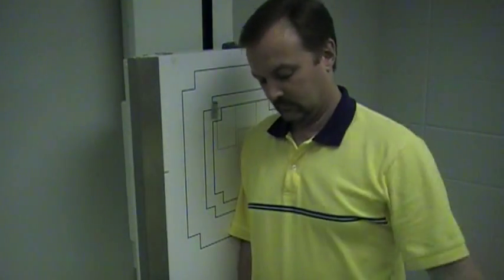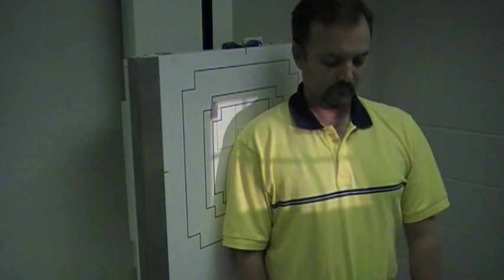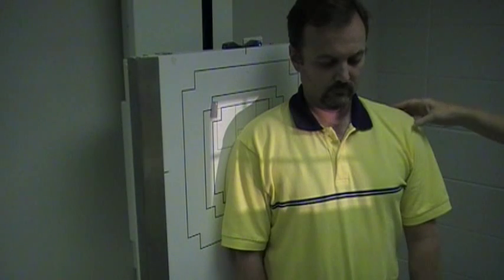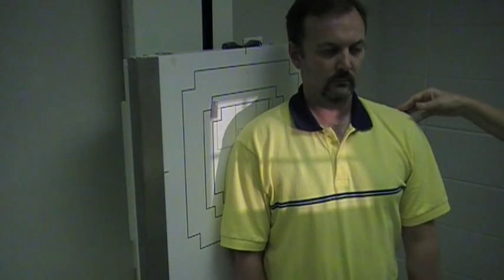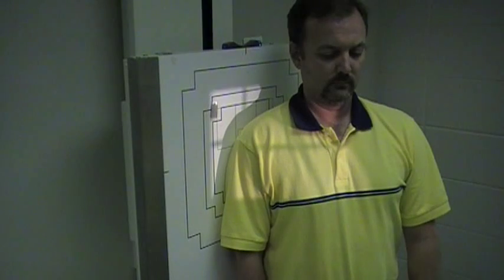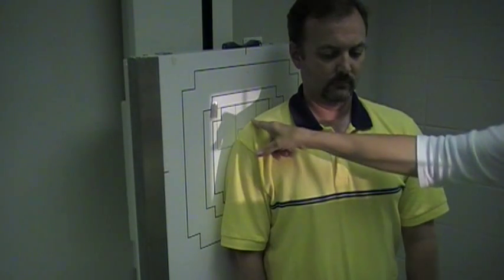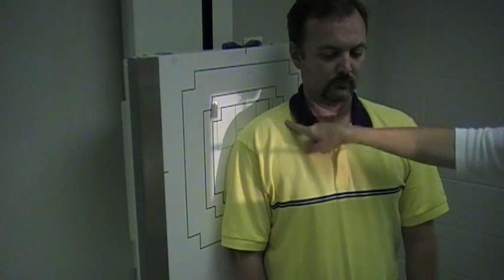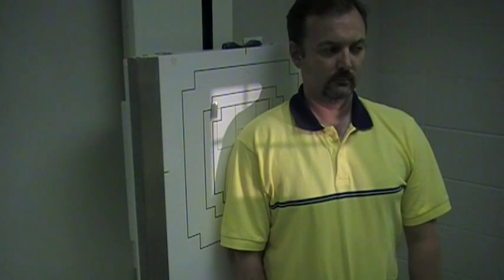Next, I'd like to show you the Grashy method, which shows the glenoid cavity. So we're going to image the right shoulder. You have the patient at an oblique angle of about 35 to 45 degrees. The central ray is going to enter — you start at the farthest portion of the shoulder, go in 2 inches and then come down 2 inches. Since I have moved my tube, I'm going to adjust the bucky tray accordingly.